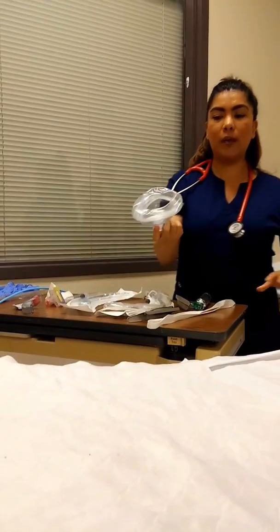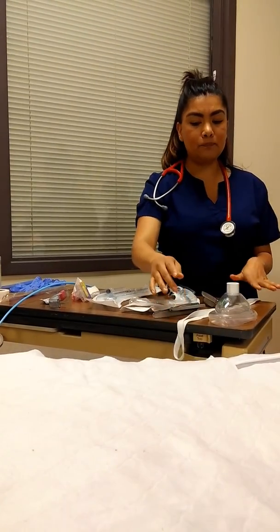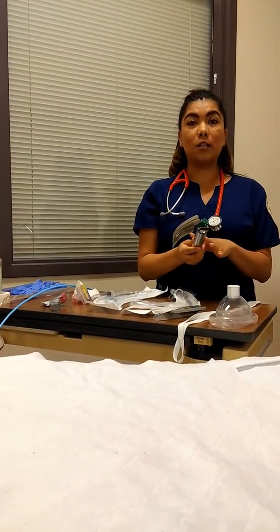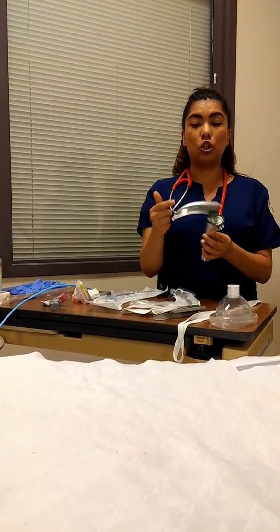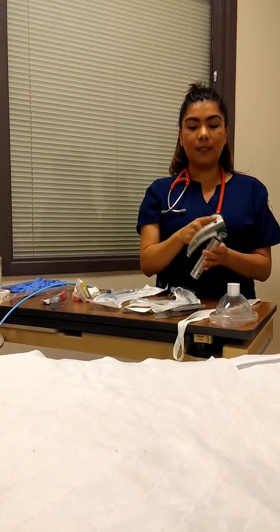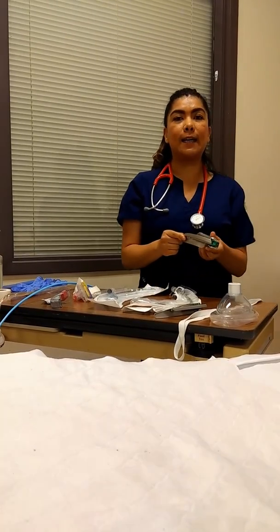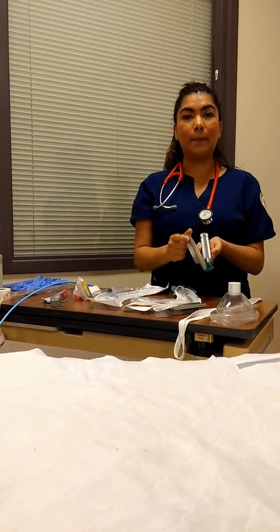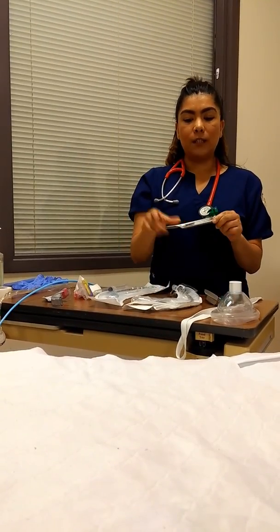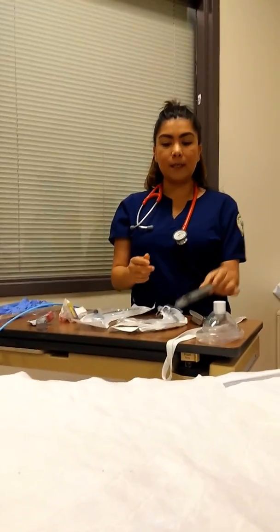We want to make sure that we have a mask that has proper pressure for it. We want our secure ties, our stethoscope, and our laryngoscope, and we want to make sure that it's working, that the light turns on and it's functioning. We want our blades. There are two different types of blades. This one is curved and it's a Macintosh blade. The way this one works is that it indirectly displaces the epiglottis, therefore it goes through the vallecula and it lifts it. The Miller is a straight blade, and this one directly displaces the epiglottis.